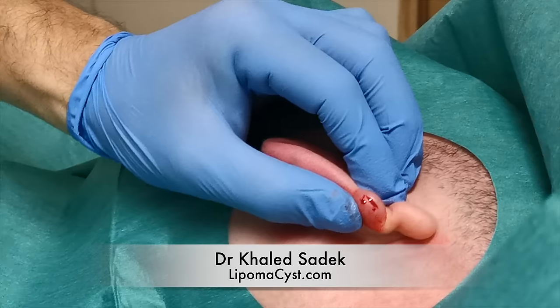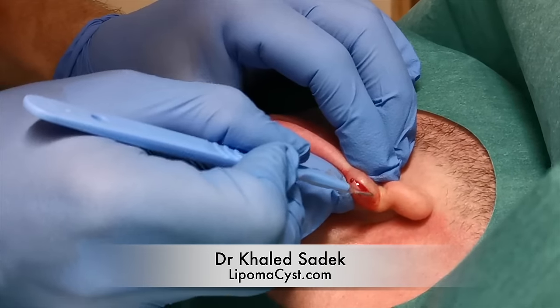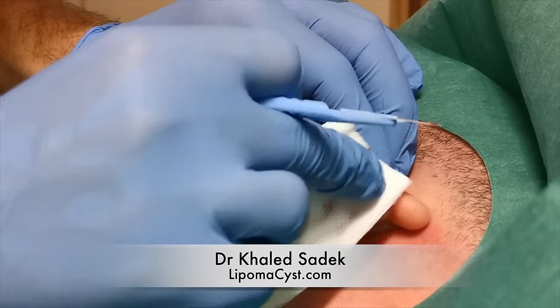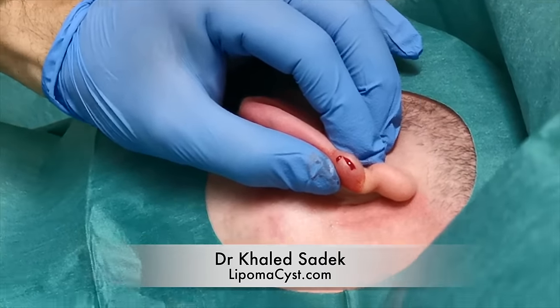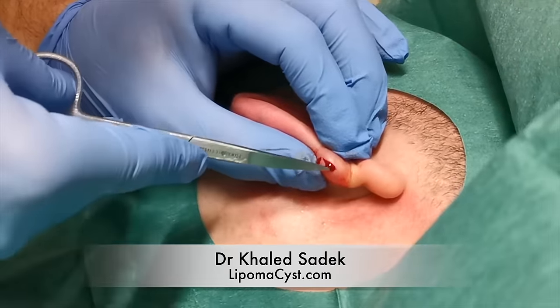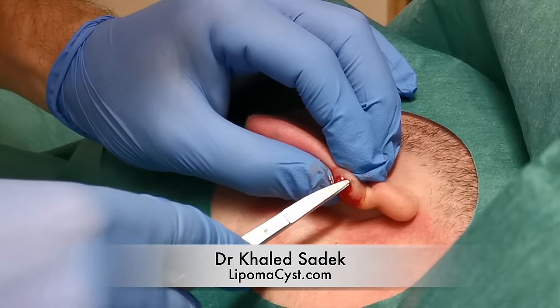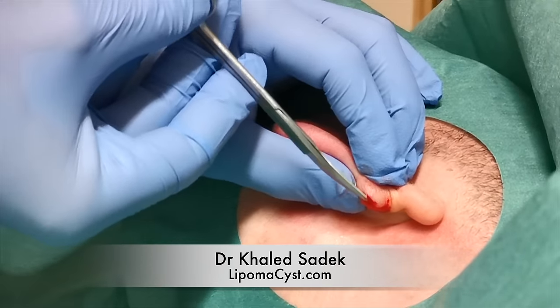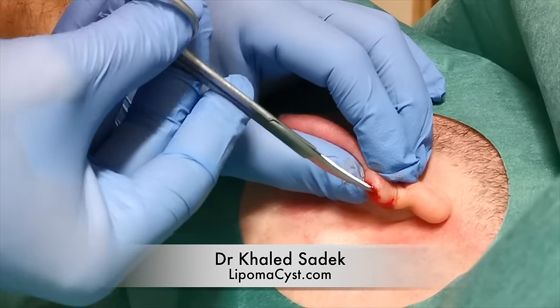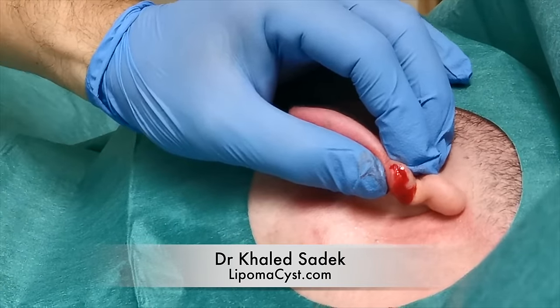What we'll do is just expose the skin above the cyst without rupturing it, and then we'll separate the skin away from it so that we get good access to it. Let's do a gentle blunt dissection here, just with the curved side of the scissors. Very small cyst and massive tools.